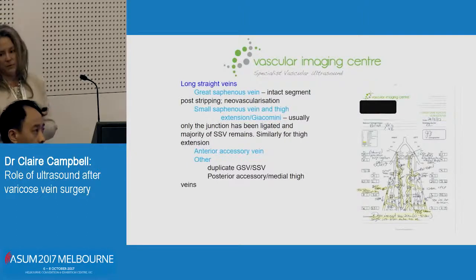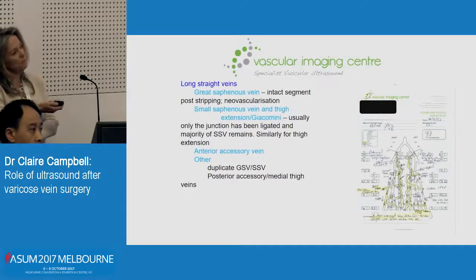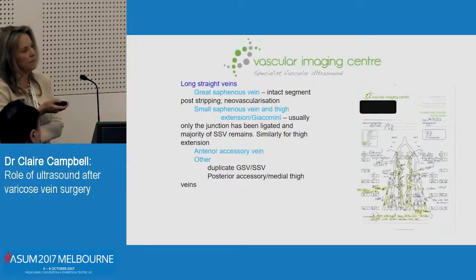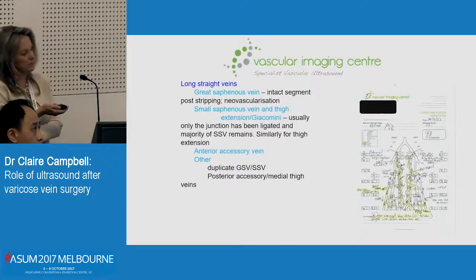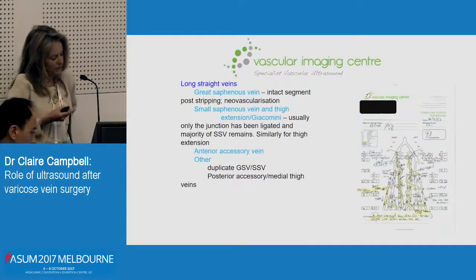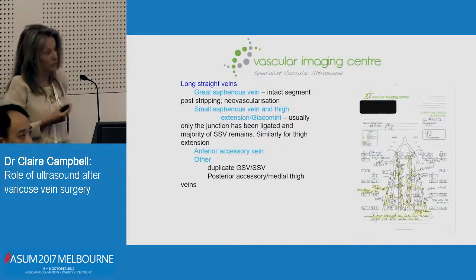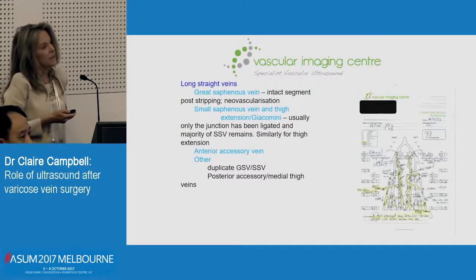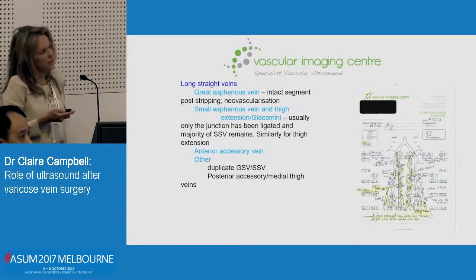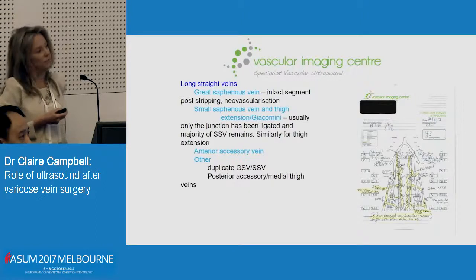This is a patient with recurrent disease. You've got a few segments of great saphenous, some incompetent small saphenous bilaterally and then lots of tributaries. You do see a lot of neovascularisation in the groin after stripping, which interestingly you don't tend to see after thermal ablation.